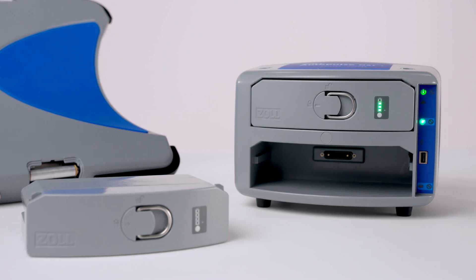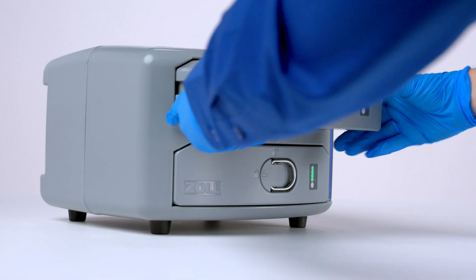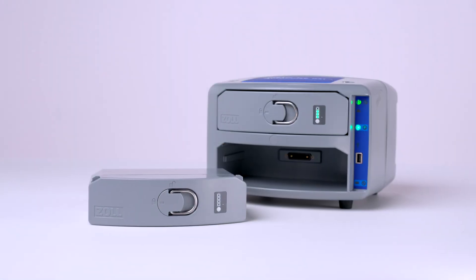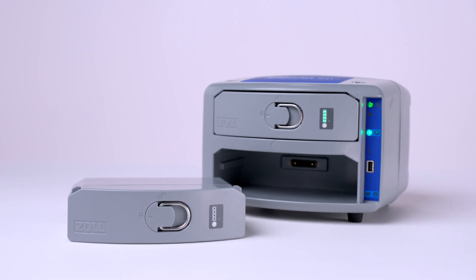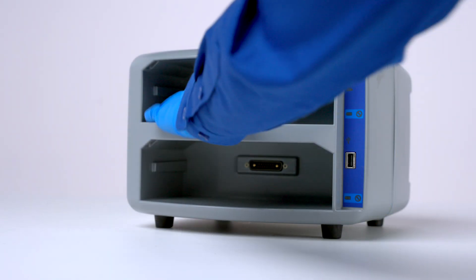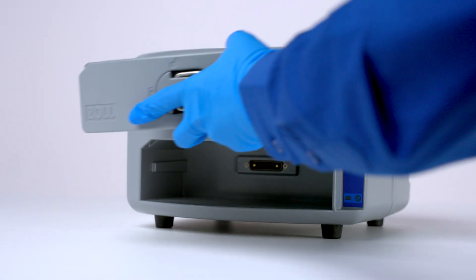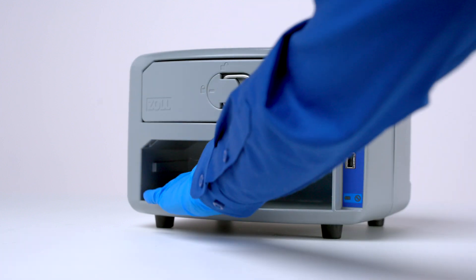New batteries are shipped at a reduced charge for safety reasons. You must charge a new battery before using it and at least once a year thereafter. The AutoPulse NXT battery charger is used to charge, test, and maintain up to two AutoPulse NXT batteries at a time. Ensure the charging bays are clear of debris or obstruction before inserting a battery into the charging bay, pushing until it properly latches into position.